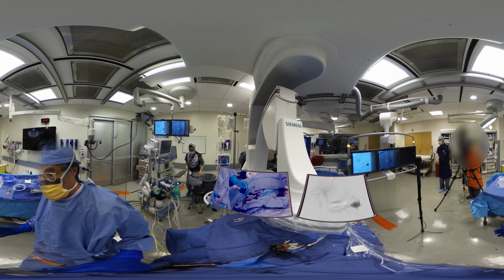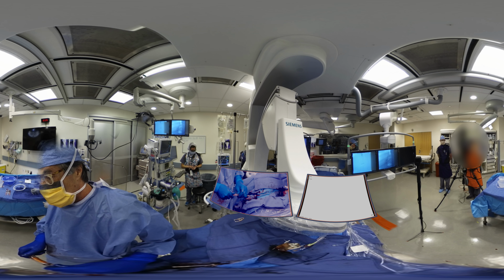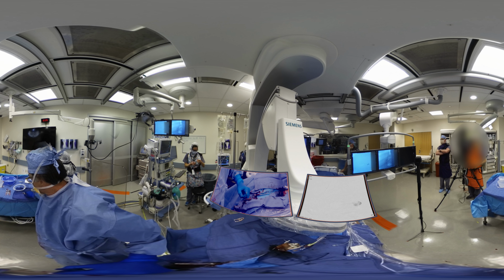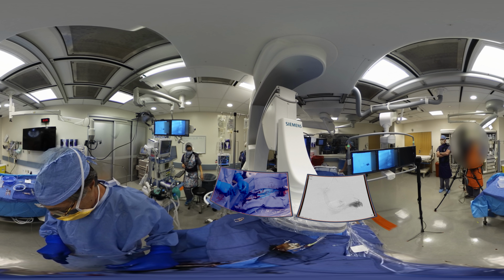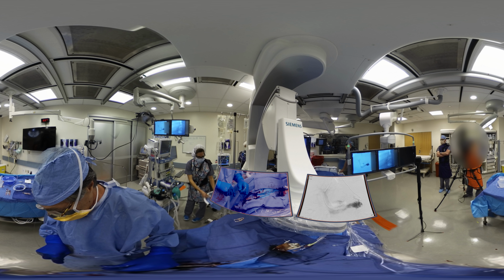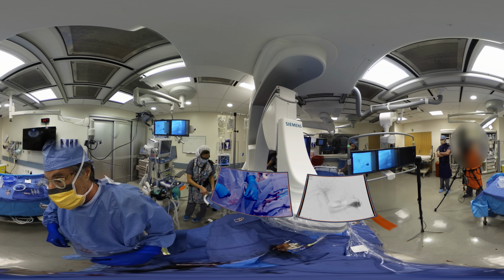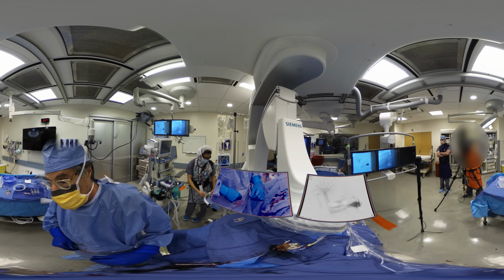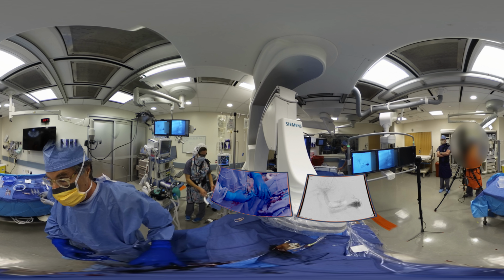And trust me, that looks entirely like the MR. There is a recanalized umbilical vein that was faintly visible. Okay, but our real pictures in terms of mapping and positioning are going to come with injecting the tract. This procedure is being done, and we can send over a reference image from that one. Let's send that reference image over.